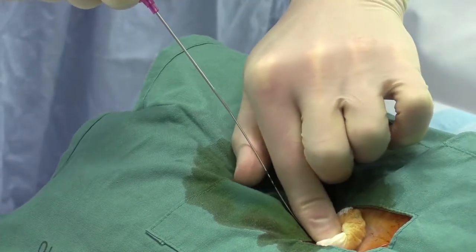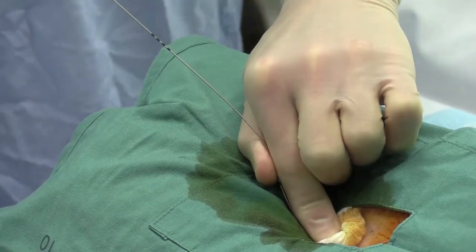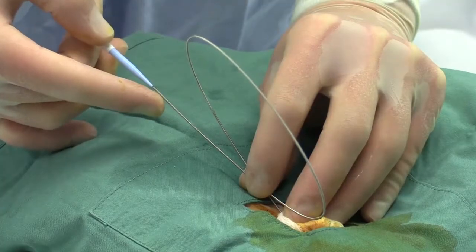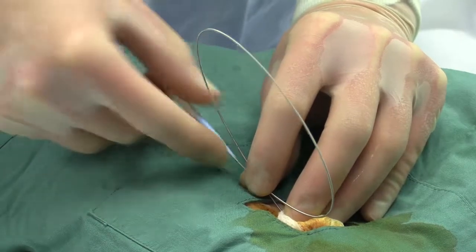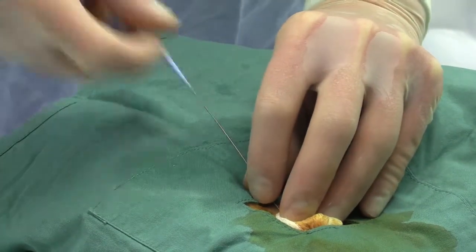Once the needle has been retracted sufficiently, grasp the guide wire so you don't pull it out during removal of the needle. Trocar and peel away sheath is then applied to the back of the guide wire.